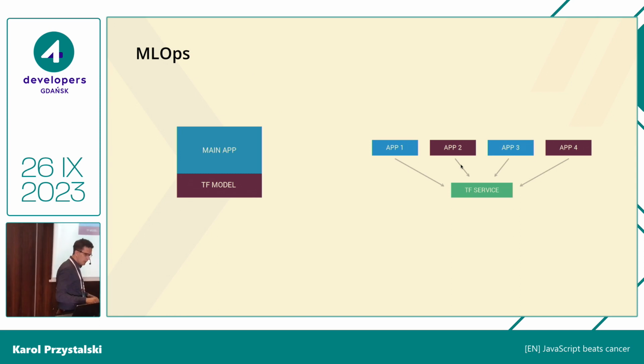So how we did that, as you can see, that's an iPhone. Not the newest one, okay? But I got this extension kit quite a long time ago. And this is an extension kit from Heine. Here you can turn it on. And you can put this model on the device, which is a good solution, in the sense that this will just work right now, right? Because executing such a model doesn't require any super GPU power, whatever. It's quite simple. Running, not training.